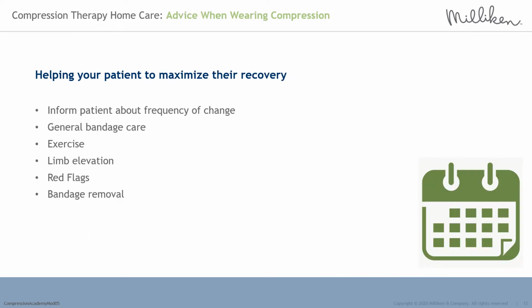Advice when wearing compression, helping your patient to maximise their recovery. It's important to inform your patient about anticipated frequency of compression change and why frequency may change from time to time as they go through their healing journey. For example, in the first 2 weeks of compression, change may be higher, 2 to 3 times a week, whilst the swelling subsides, and then change may be reduced to once or twice weekly.